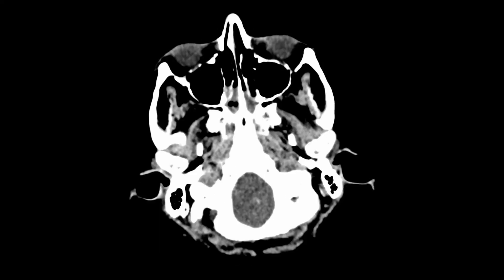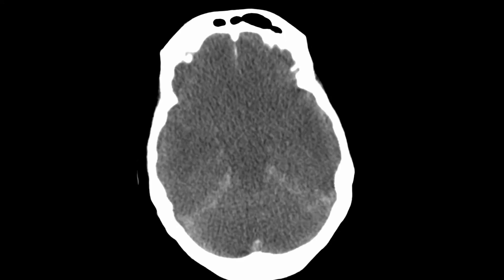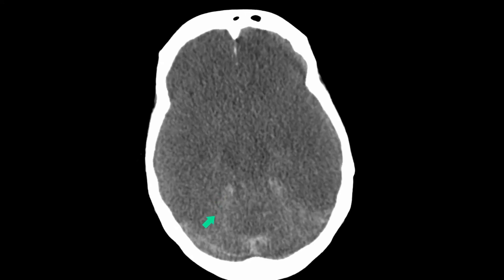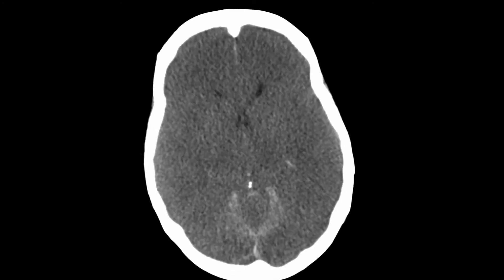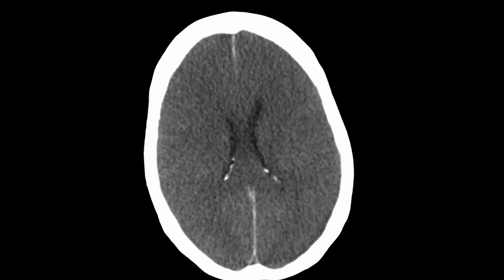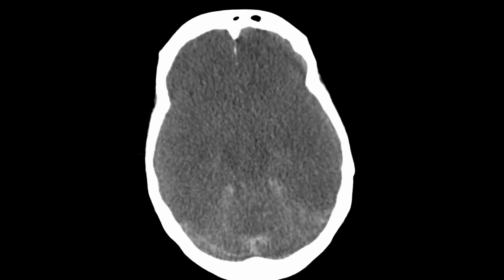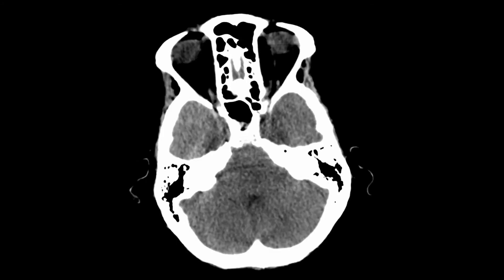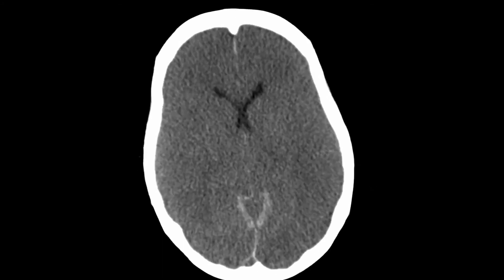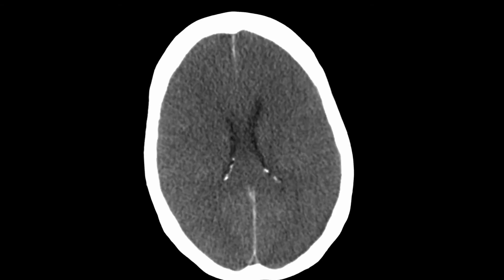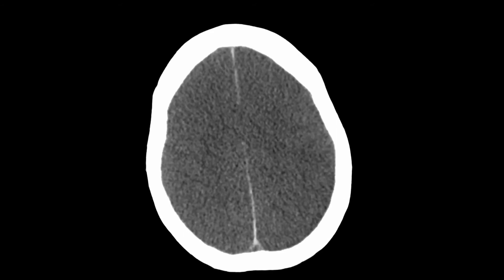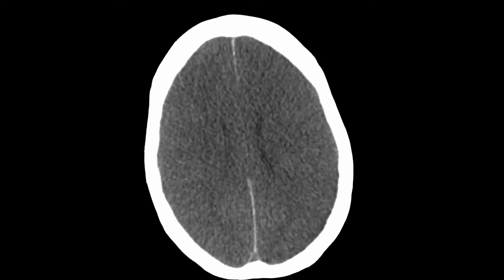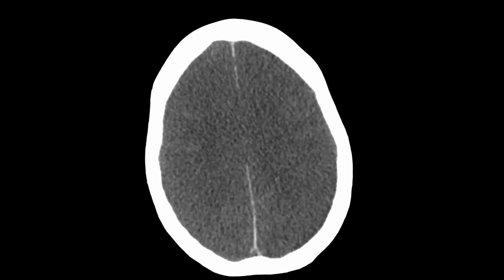Here is the CT of this patient. You can see the pseudo-subarachnoid sign going around the superior sagittal sinus. There is complete effacement of the sulci, effacement of the basal cisterns and effacement of the lateral ventricles. There is global loss of density in the brain parenchyma and the falx appears dense. This is the pseudo-subarachnoid sign.